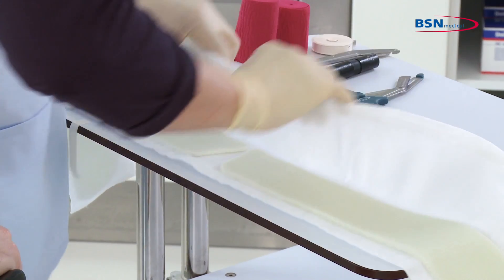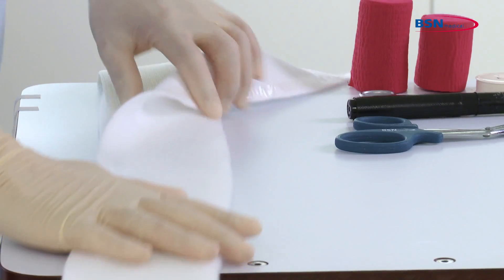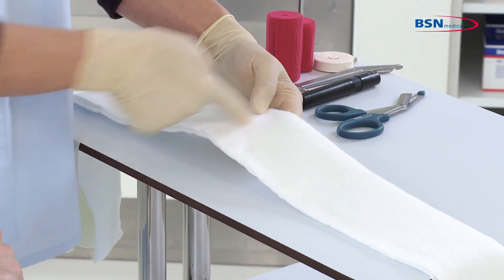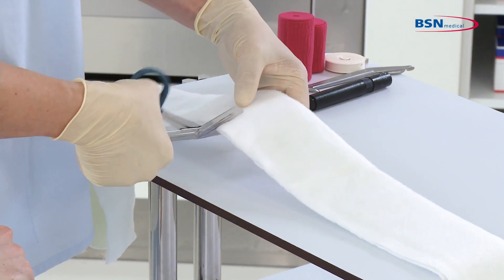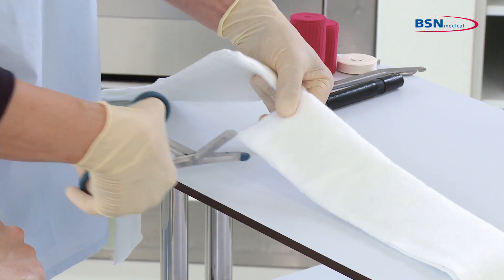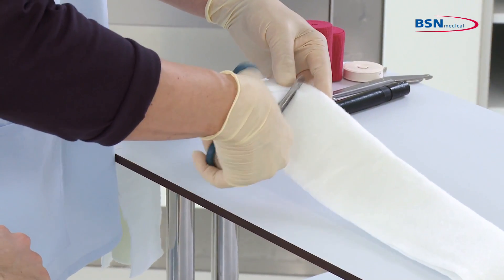Then close the padding again. Cut the padding in the middle, following the triangle shape of the substrate gap and leaving a margin of padding on either side. Do not cut the padding completely — leave one finger width of padding intact at the triangle tip.